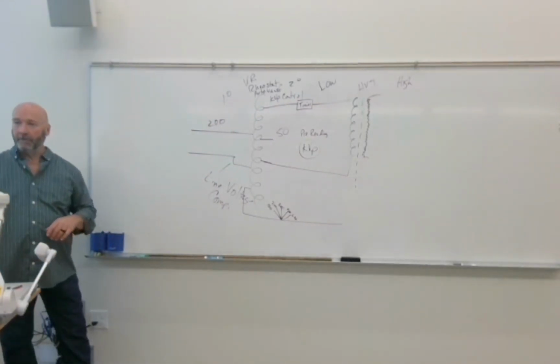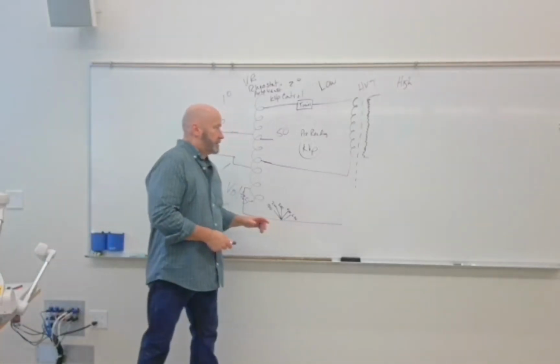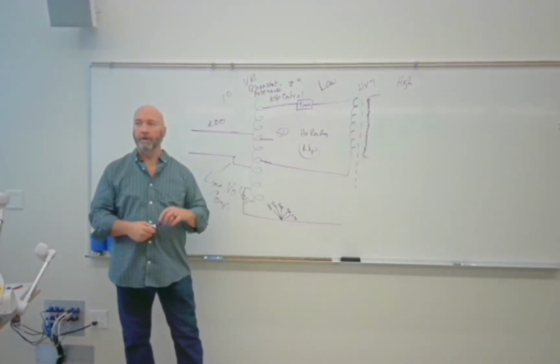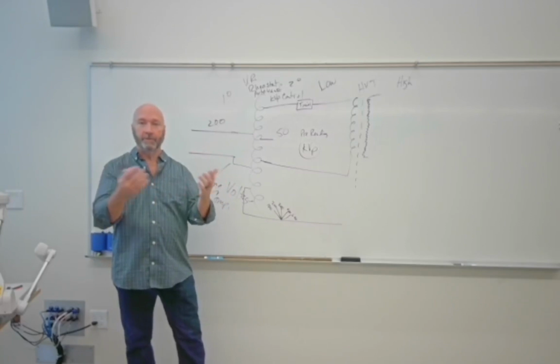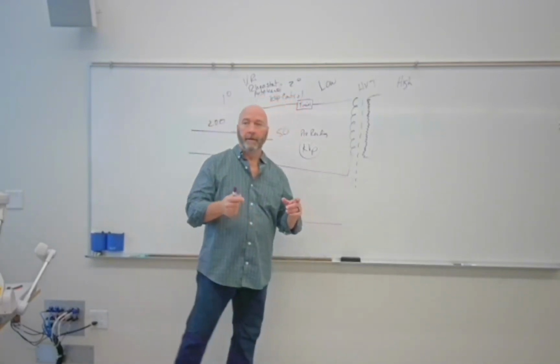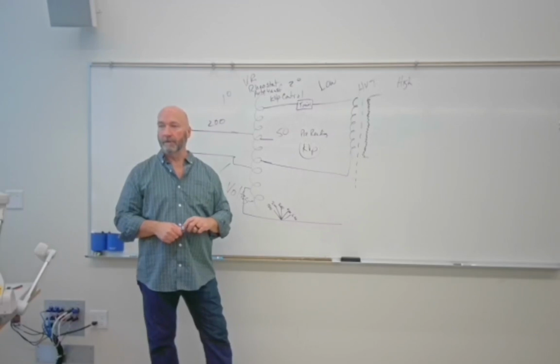mA is milliamperage. Amperage is just a measurement of electrons. That's all it is. So you saw the X-ray tube, right? How far was the cathode end of the X-ray tube? And I'll define exactly what all is in the cathode end of the X-ray tube later. How far was it from the anode? Not very far. Not very far at all, right?